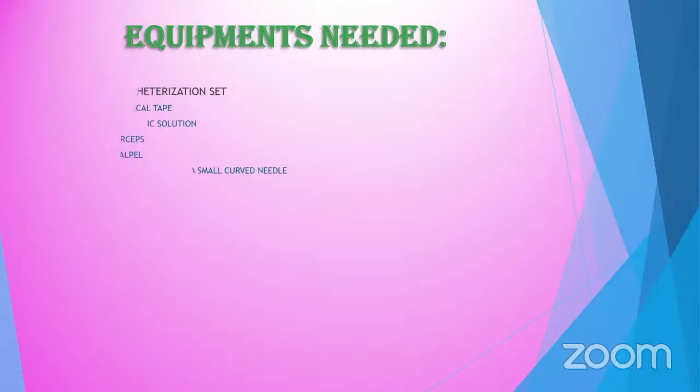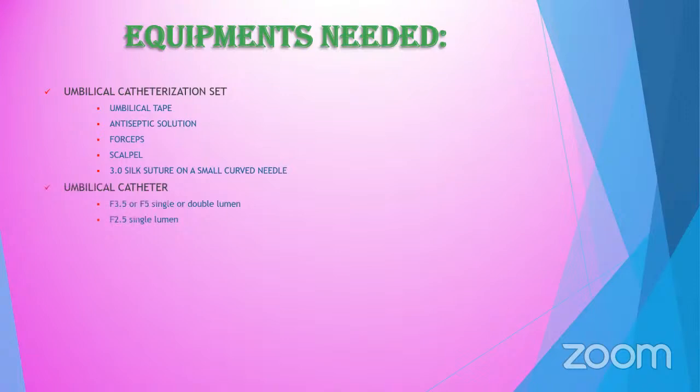So what are the equipments needed? We have the umbilical catheterization set. This includes the umbilical tape, antiseptic solution, the forceps. Later, we will show all the equipments needed. Yes. Later, doctor. We will show later.